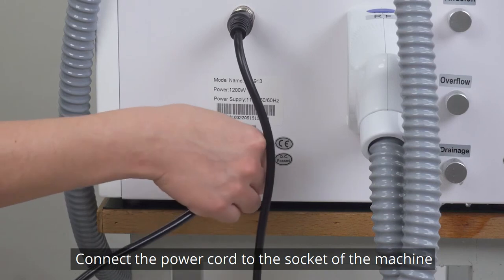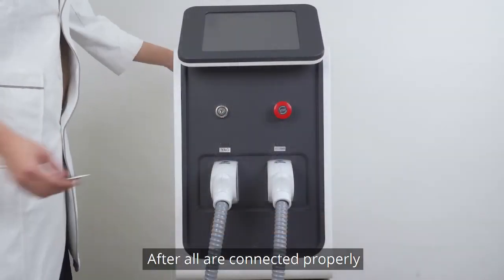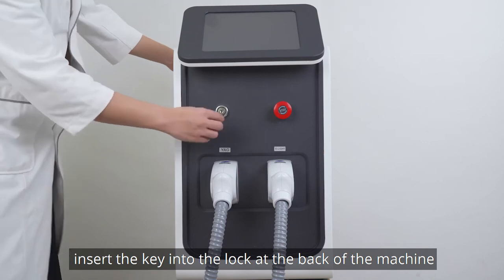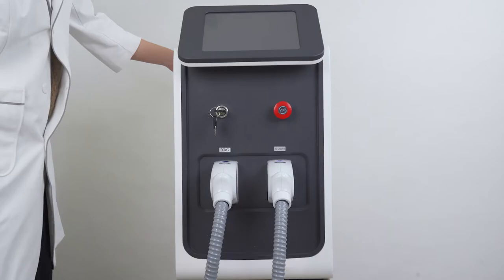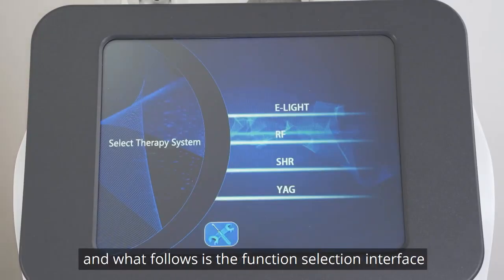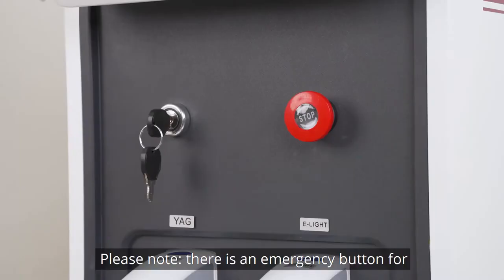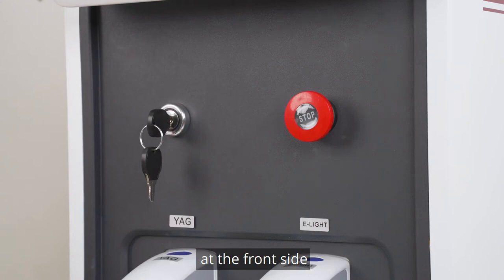Connect the power cord to the socket of the machine. After all connections are made properly, insert the key into the lock at the back of the machine and turn it to get the machine started. The welcome interface will appear, followed by the function selection interface. Please note there is an emergency button for turning off the machine at the front side.